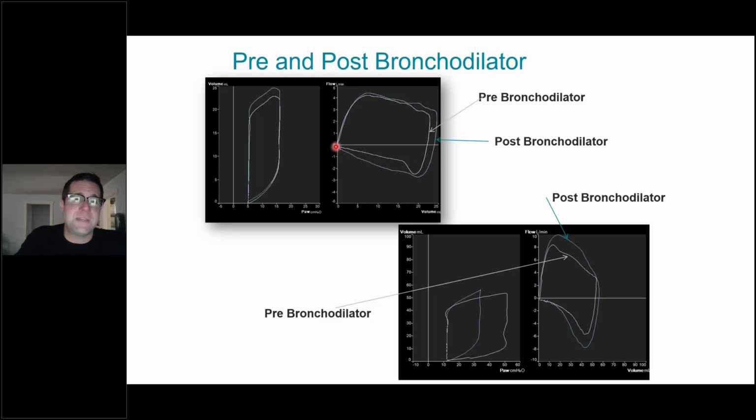And so you see here that the inspiratory flow goes in and then exhalation occurs, and then it kind of takes some time to get out, and that's usually the PEEP exhalation valve coming in. But if you look at your peak expiratory flows, and this is another example where this patient had a really good bronchodilator response, that's when the valve gets out of the way, and we're not trying to regulate PEEP at all. But if you have curvature like that and you're able to avoid some of that curvature and increase your peak expiratory flow, then that's usually a good thing. Job done. They have a good bronchodilator response.